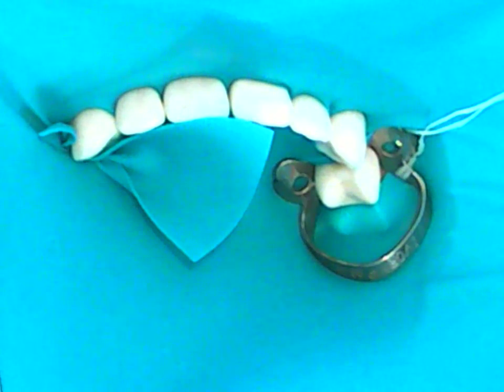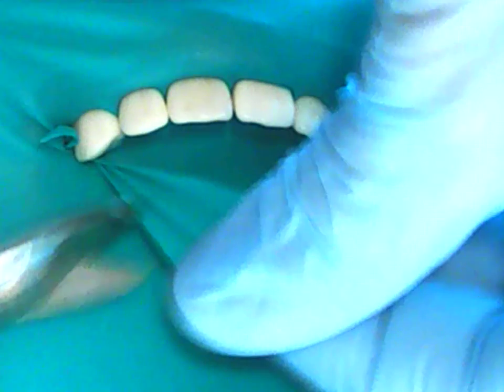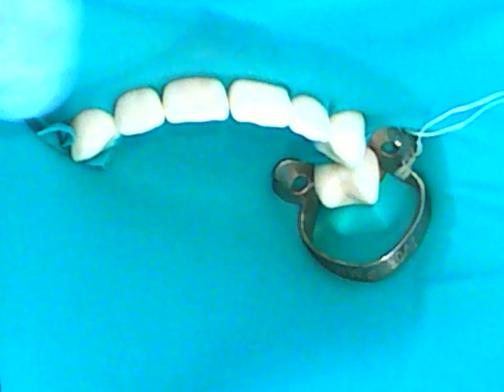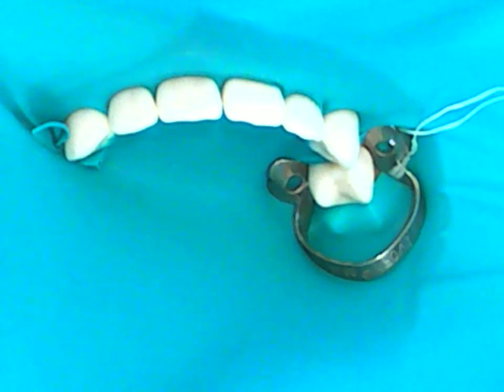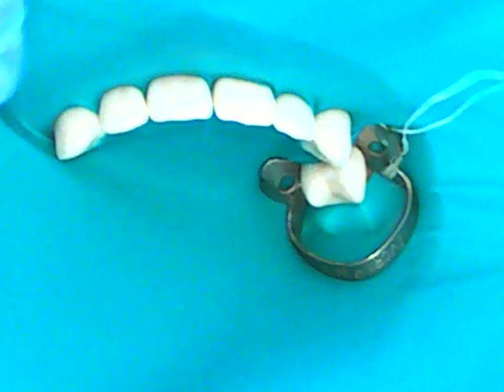Of course we won't want to leave that extra piece of dental dam under on the lingual aspect, so you would just trim it with your scissors. Just stretch it. It's attached nicely on the contact. On the facial, you want to leave a little tag like that out so that you can hold on to it and remove it if required, which I'm going to do right now. Again, you can use the cotton pliers, or I think it's just as easy to get a hold of it with your fingers and pull it out.